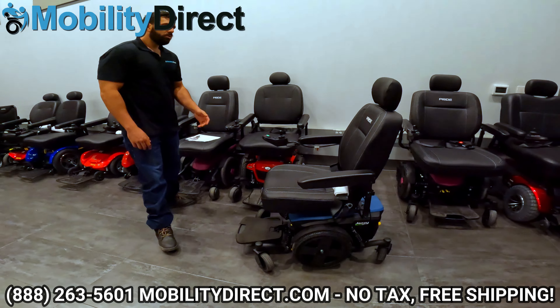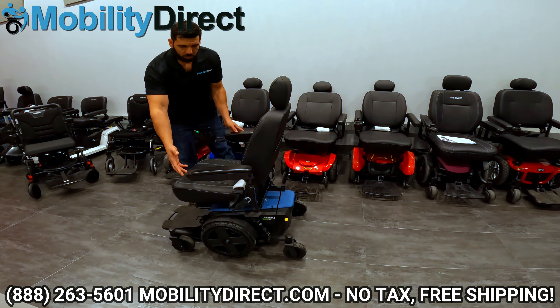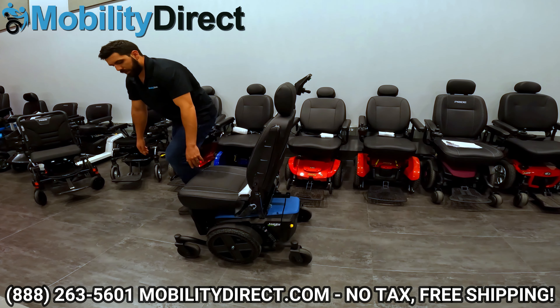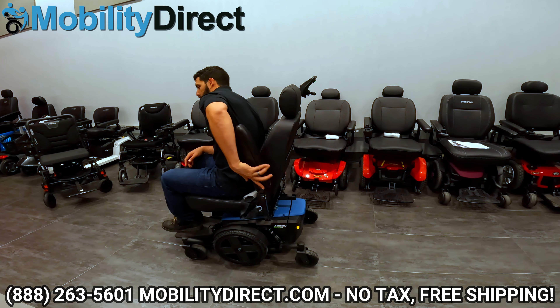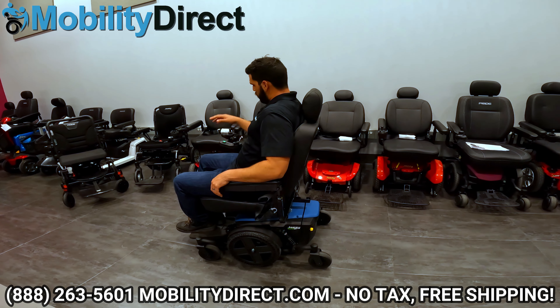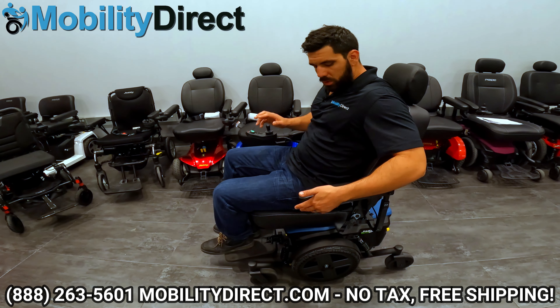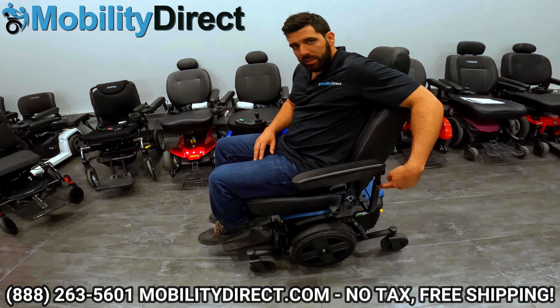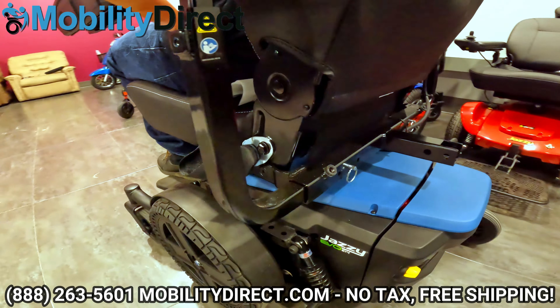Now I'm going to start showing you some of the comfort adjustment features on this chair. When you're getting ready to get in, you can flip the armrests up which sometimes makes it easier for users. You can also flip the foot plate up, and once you're in, flip it back down and bring the armrests down. The joystick is mounted on the right side but you can easily transfer it from the right to the left side. Aside from the armrest being flip-up, you can also adjust the height of the armrest — there's a little set screw here. Use your Allen key from the user manual bag to loosen that set screw, bring the armrest up higher or lower, and then retighten.